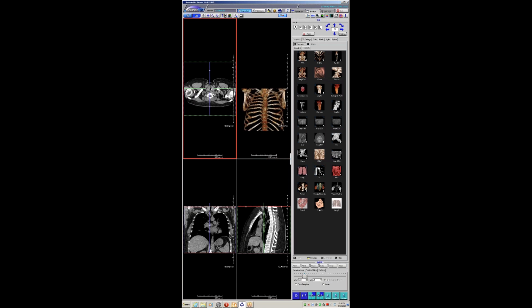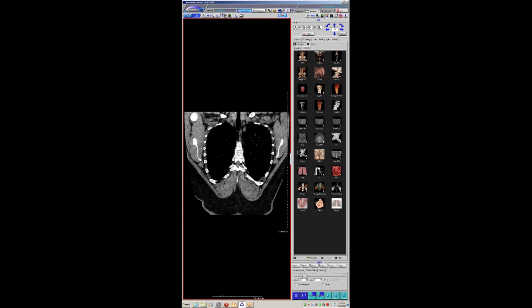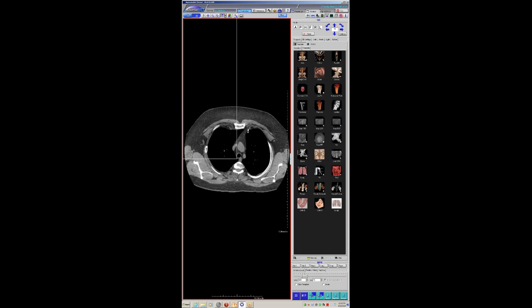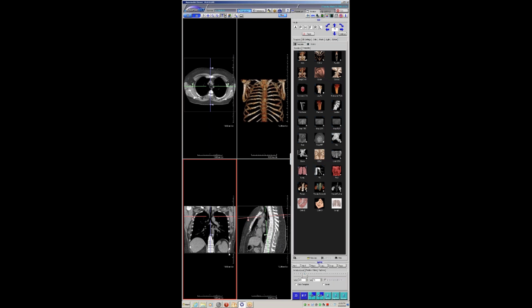Quick question regarding pericardial mesothelioma. I have one case radiograph from when I was a resident of a patient with bilateral pleural plaques and pericardial plaques, which I guess were presumed asbestos related. For everybody else out there, have you seen other cases of presumed asbestos plaques in the pericardium?